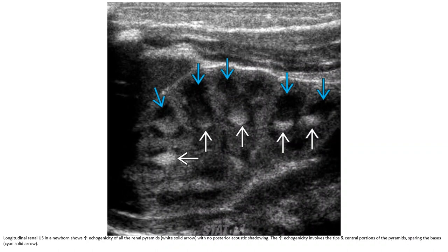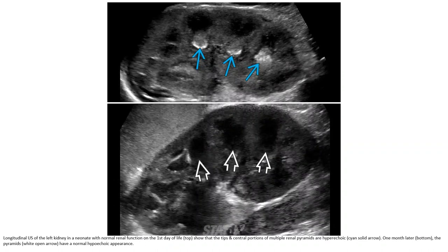The renal ultrasound of a newborn shows increased echogenicity of all the renal pyramids with no posterior acoustic shadowing. The increased echogenicity involves the tip and central portions of the pyramids, sparing the base. In a neonate with normal renal function on the first day of life, the tip and central portions of multiple renal pyramids are hyperechoic. One month later, the pyramids have a normal hypoechoic appearance.